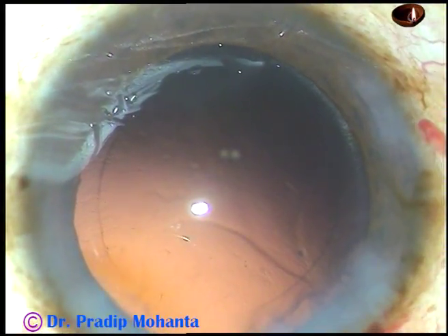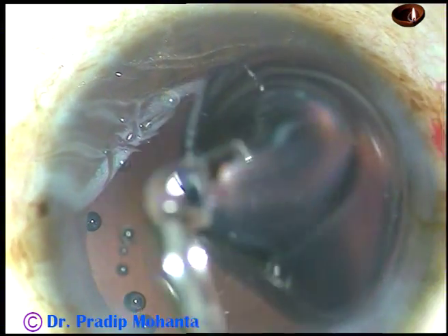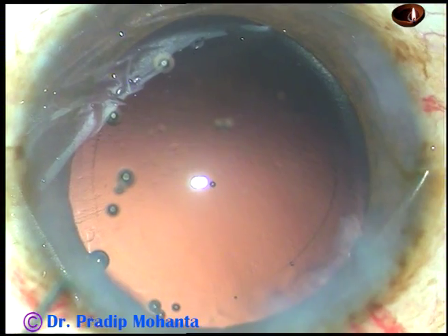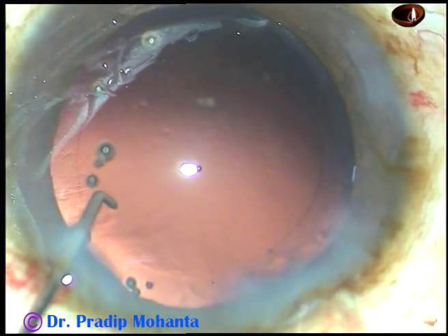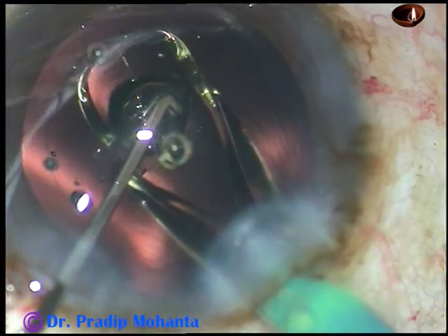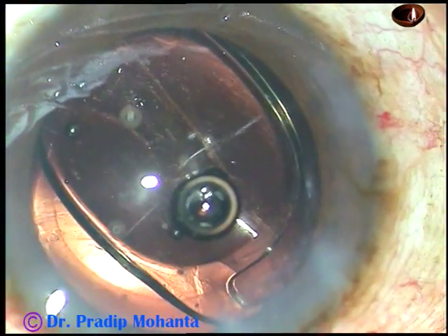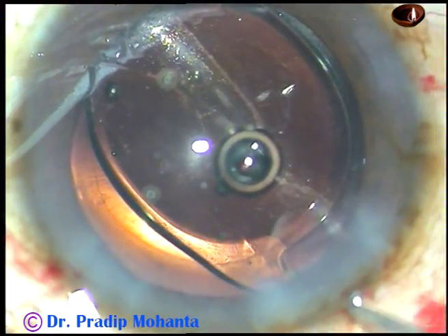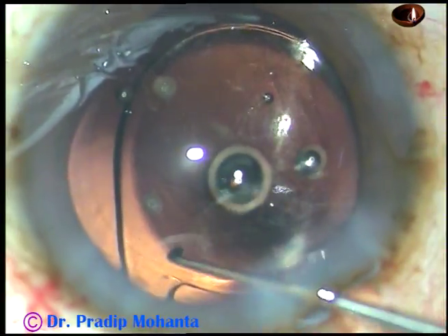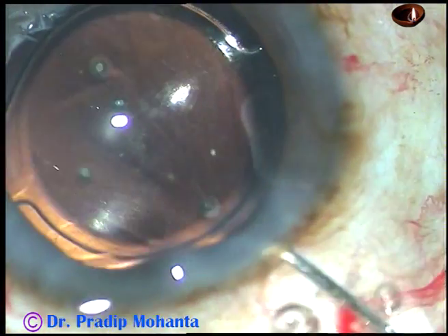2% hydroxypropylmethylcellulose is again injected and the anterior chamber and capsular bag are filled up with the viscoelastic substance. Now here goes the hydrophobic acrylic intraocular lens — this is from Appa Sami Associates. This is a beautiful lens; I have no financial interest, but I have a follow-up of more than 4 years and there is no glistening and very minimal PCO. The lens is in the bag now and the posterior lip is depressed; some amount of viscoelastic comes out.